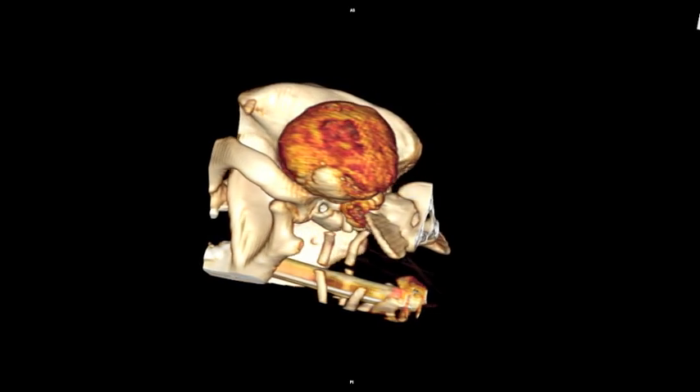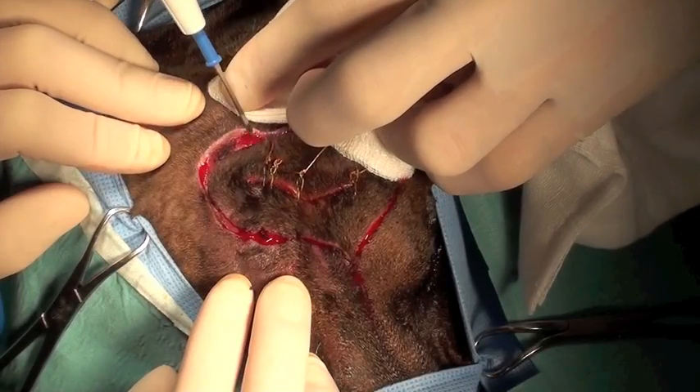This 3D volume rendering shows the multilobular osteochondrosarcoma attached to the caudal end of the skull.